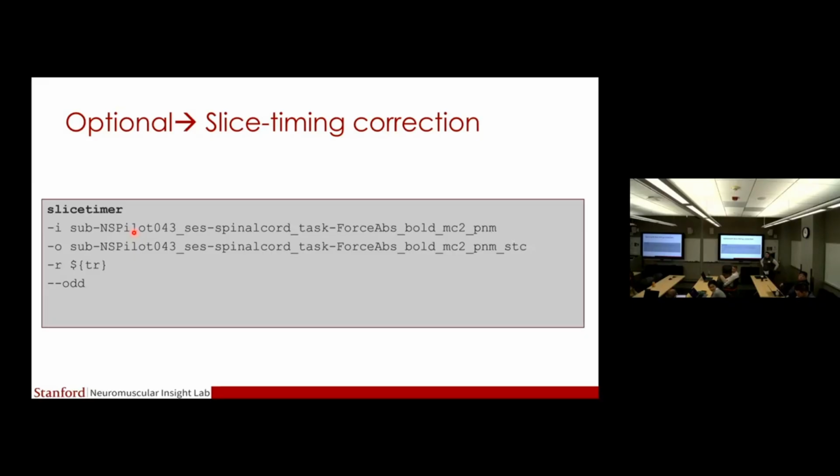You get one level of interpolation from the things that you are doing, and it depends on how much you are willing to sacrifice the signal for interpolation and all the trade-offs. But with a long TR, that could be a big problem. Yeah, I agree with the long TR. With a short TR, up to 2 seconds, I think you might introduce more artifacts than you actually improve the data.